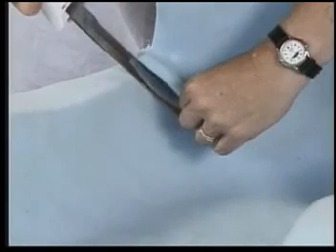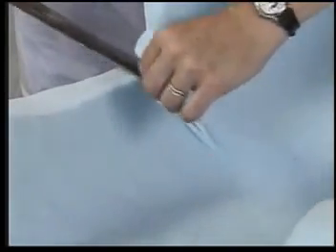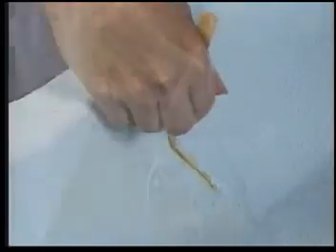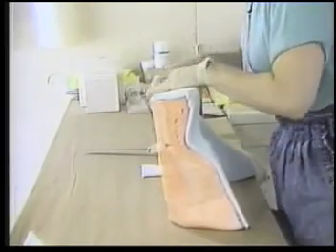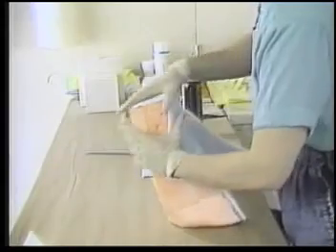area. To make the dart flush with the rest of the insert, simply trim the excess laminate almost flush with the insert. Spray the cut area with adhesive. Then use a tongue depressor to push it closed. Once this has been done, trim the excess quarter-inch laminate flush with the insert edges. With the inside surface completely layered with a soft, smooth finish, the insert is ready for a fabric covering.